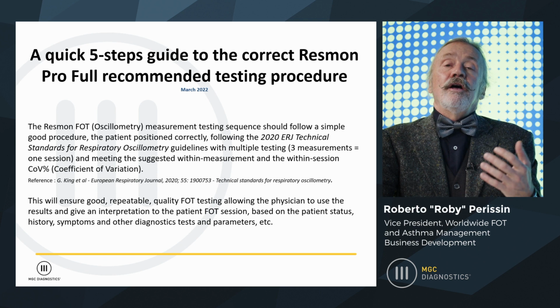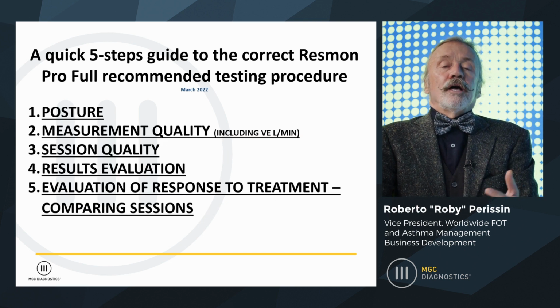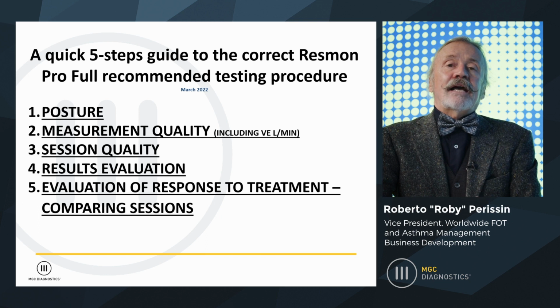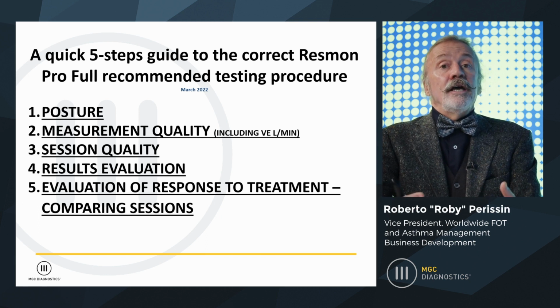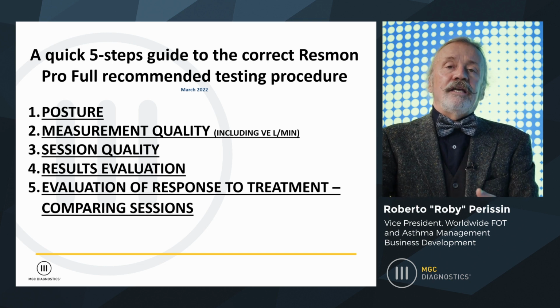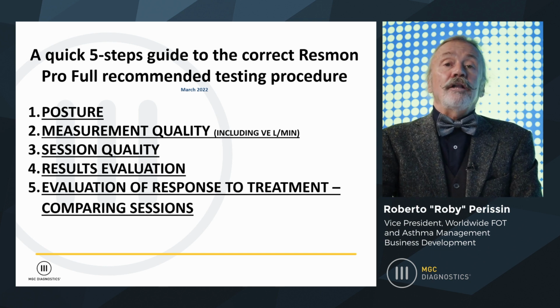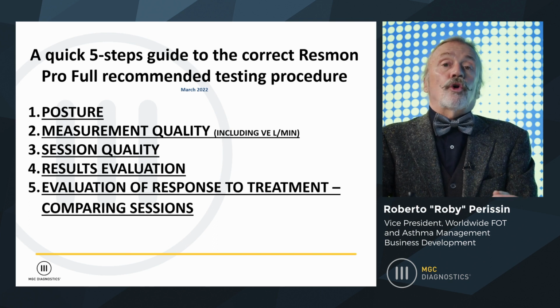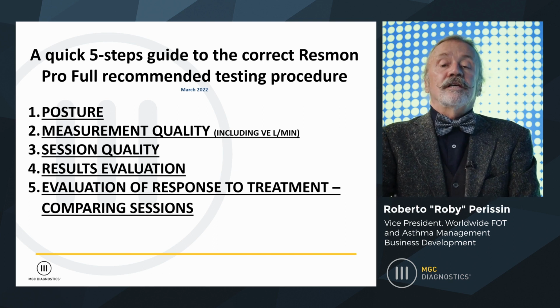And that will involve checking for correct posture, checking for the measurement quality, the single first measurement, including a low ventilation, a quiet breathing patient, performing a second and a third measurement, and then it becomes a session. Evaluate the results, seeing if it's outside of the normal values or not, performing eventually a treatment, and evaluating the response to treatment. So comparing a pre to a post session.